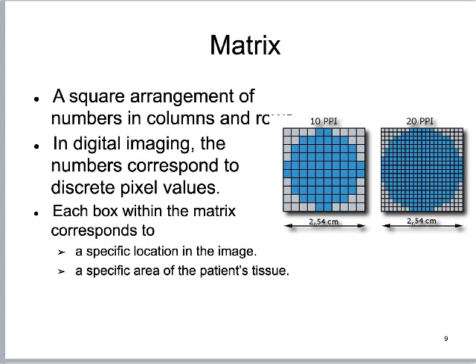If it is worn by a person whose leg is the right size, I will not be able to see the weave of the pantyhose, right? But if a man puts on those pantyhose, guess what? They become fishnet stockings really quickly, right? The weave expands. Why? Because I stretched it much bigger than it was meant to be stretched.